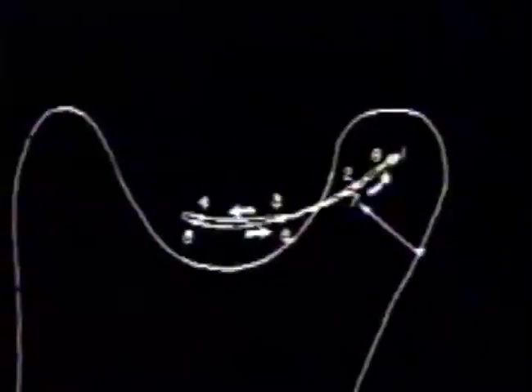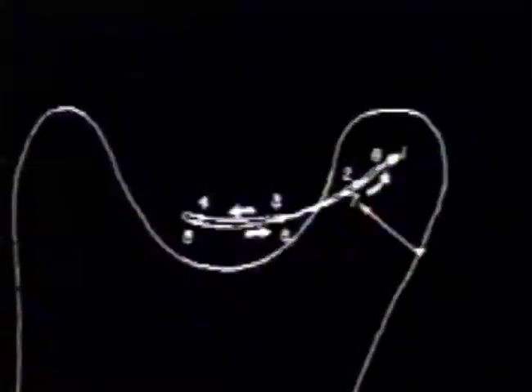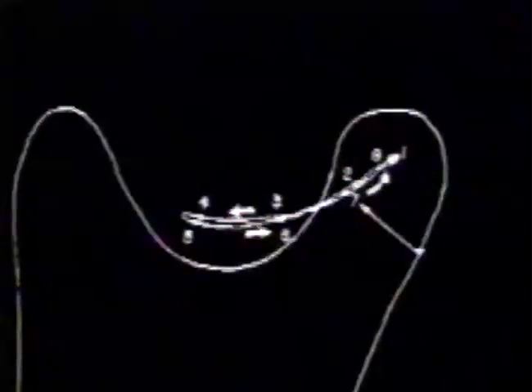The separation begins during the closing stroke, before the teeth have contacted the resistance created by food between them. From point 7, the working condyle moves upward and forward through point 8 to its intercuspal position at point 1, guided by tooth contact. The non-working side shows little evidence of separation between its opening and closing tracings.